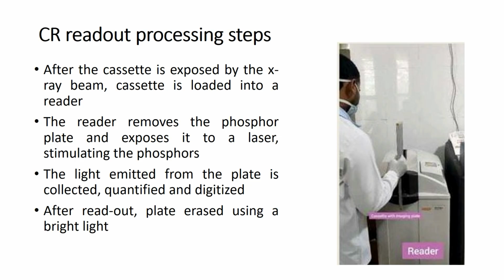The reader removes the phosphor plate from the cassette and exposes it to the laser, which stimulates the phosphors. When the laser interacts with the phosphor layer, the light emitted from the plate is collected, quantified and digitalized by the system.